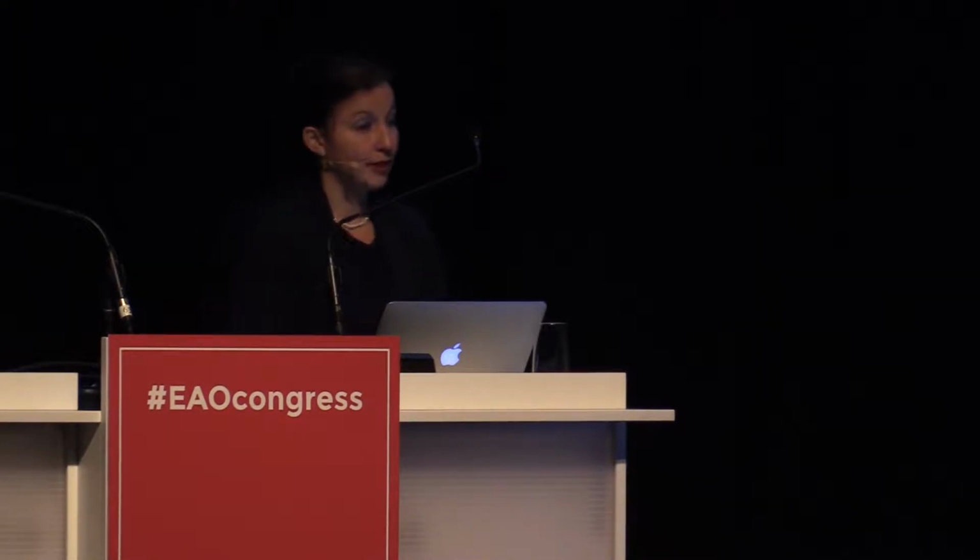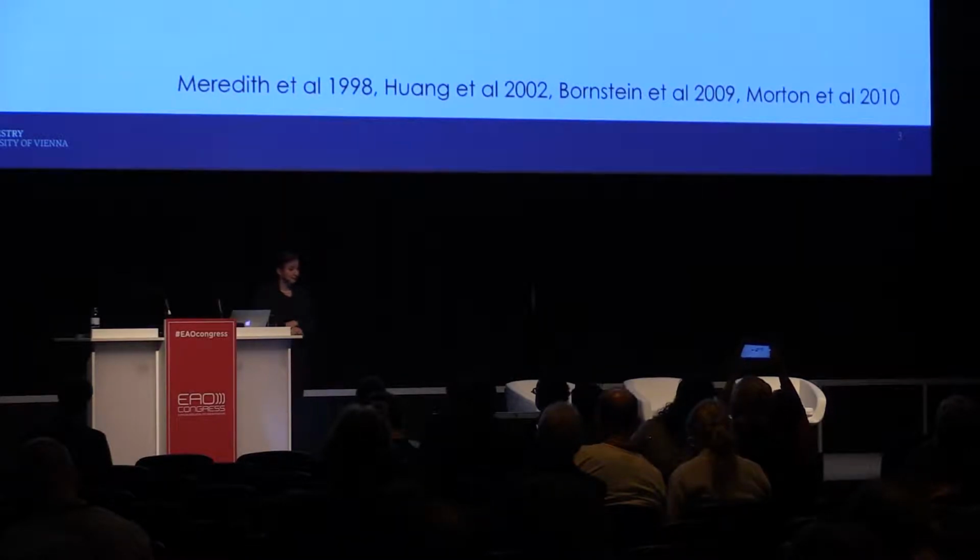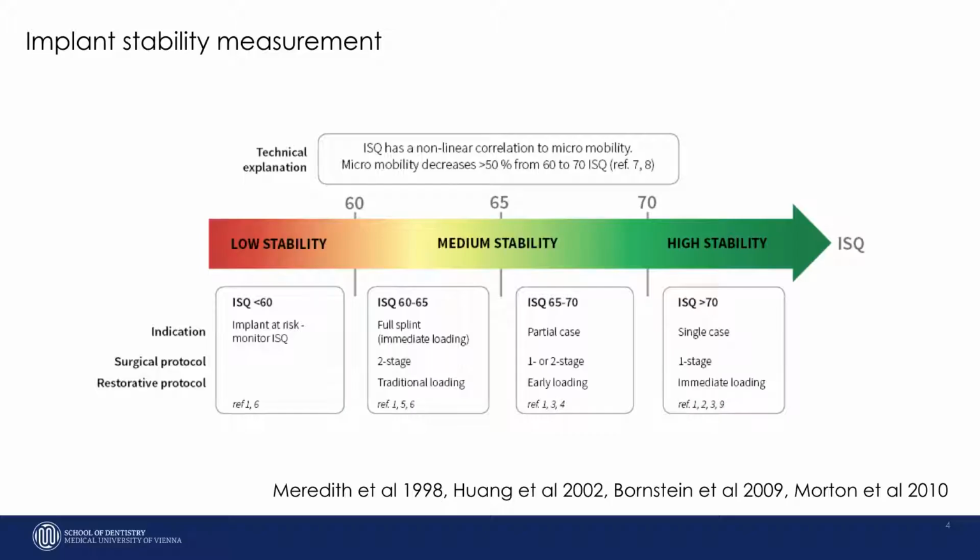As Paul also highlighted, the average age of our patients is getting very high, and people really stress very fast loading protocols. So I think this is a perfect tool to communicate not only to the dentist but also to your patients. When you look at this slide, this is what you find at the Osstell homepage, and it reflects which numbers of implant stability you try to reach and how this influences your loading protocols in the long run.